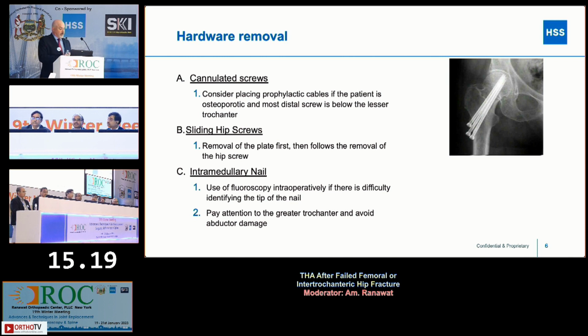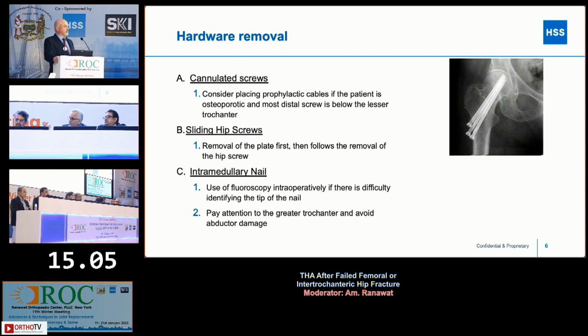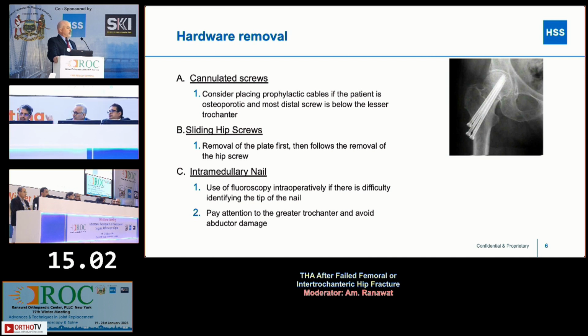All right, let's talk about sliding hip screws. How are we gonna get those out? Give me some tips. I think with a sliding hip screw, it's sometimes more difficult to get a primary in 100% because of the length of the plate being used. If someone used 2 holes, it's fair enough, but with long plates, we might require some sort of long stem to go across the last screw hole, a couple of centimeters down the line. And it is sometimes difficult to remove those things because of the large hole made on the lateral aspect. So beware of a fracture, and prophylactic wiring is probably far better in a DHS situation rather than with CC screws.